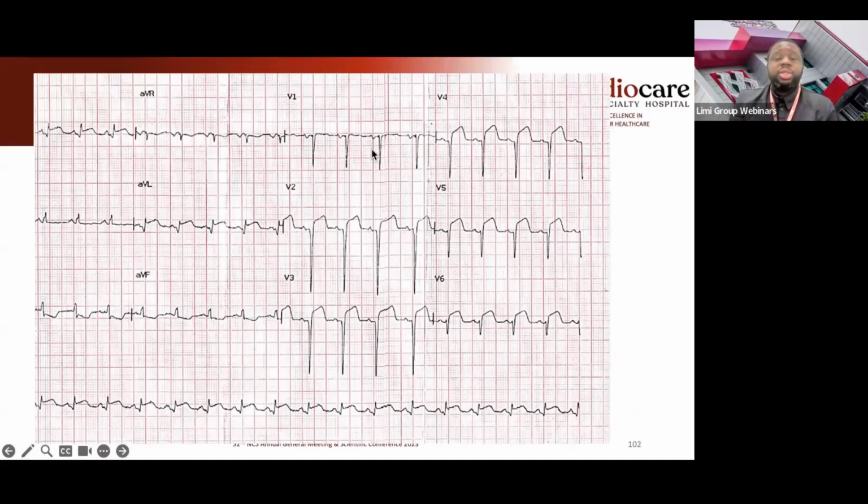So what can we see on this ECG? Anybody? For those that have been on our webinars, you should be able to do an ECG. For those that attended ACS, South African flag sign. I like that. Jacinta says ST elevation. ST elevation where? We also talked about what we call contiguous leads, meaning that ST elevation should not just happen in one lead, it should happen in multiple leads. Okay, somebody says anterolateral STEMI. Those are senior people. Anteroseptal, beautiful, beautiful. Thank you so much.